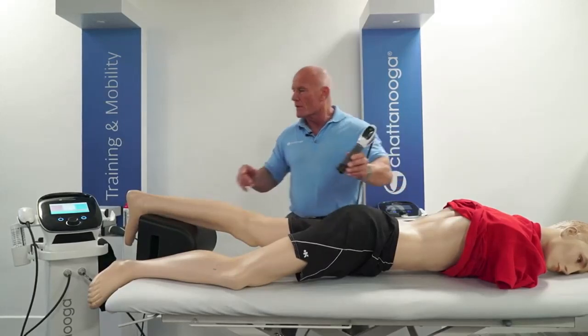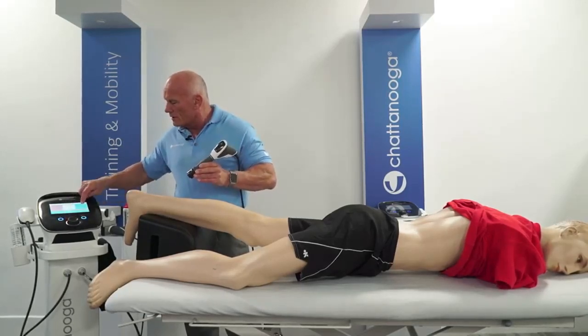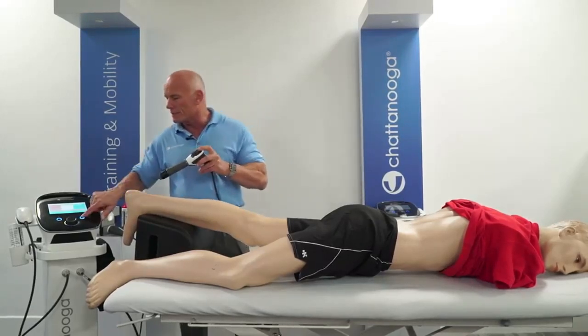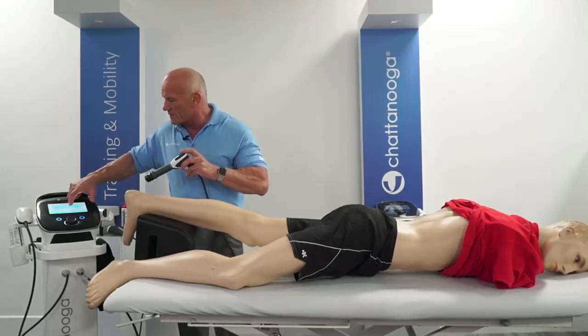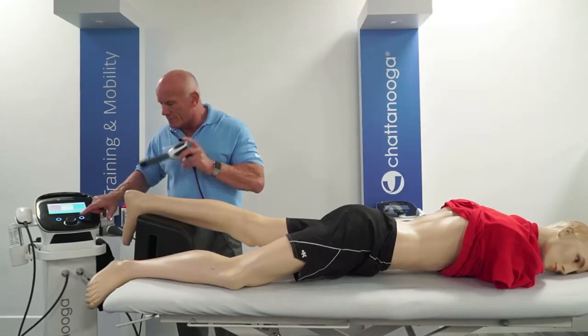I will go back to my frequency, and I'm going to move this up to a more usable, user-friendly frequency between 12 and 15 hertz. And that sounds like this, he says. Treatment. Okay, got that. Okay?